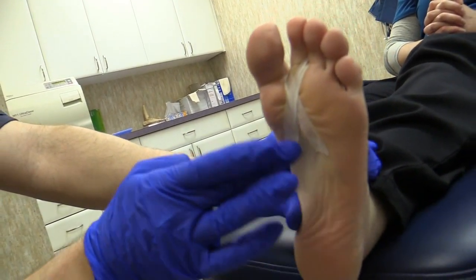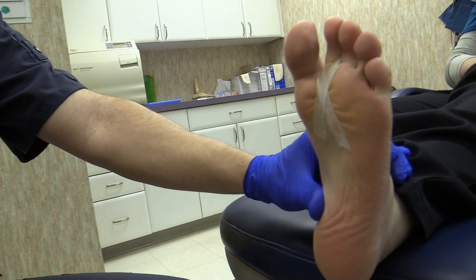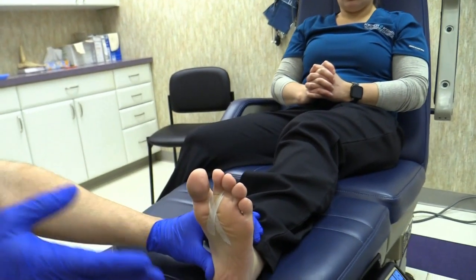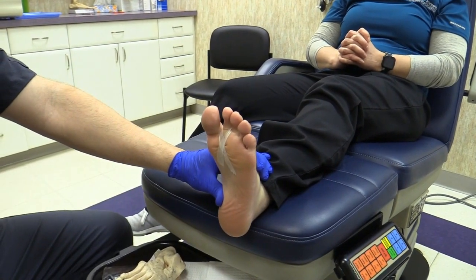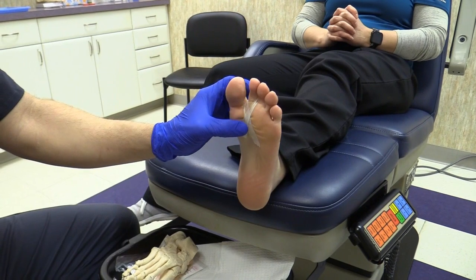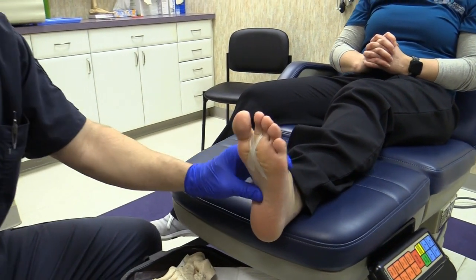It looks like that. If you have lotion or oily skin, you'll have to wash your foot so the tape will stick better. The proper amount of tension — you might have to loosen it or tighten it a little bit — but you want it to be stabilizing the toe when you stand. This can also be used prior to sports or running to stabilize the toe and reduce a lot of that pain, which will typically be at the ball of the foot.